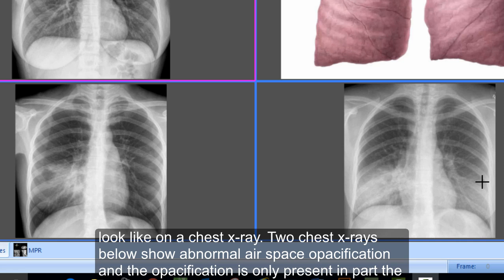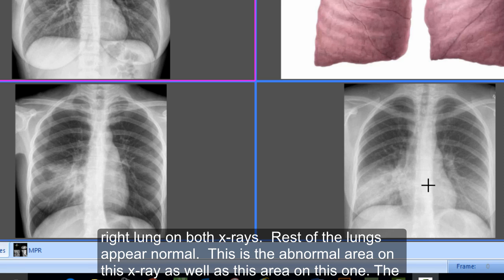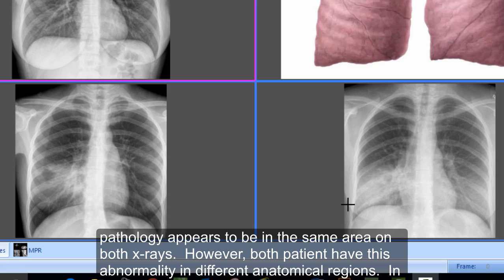The two chest X-rays below show abnormal airspace opacification, and the opacification is only present in part of the right lung on both X-rays — the rest of the lungs appear normal. This is the abnormal area on this X-ray, as well as this area on this one. The pathology appears to be in the same area on both X-rays; however, both patients have this abnormality in different anatomical regions.